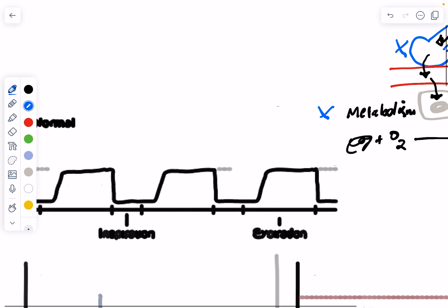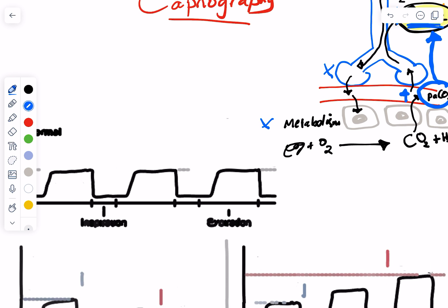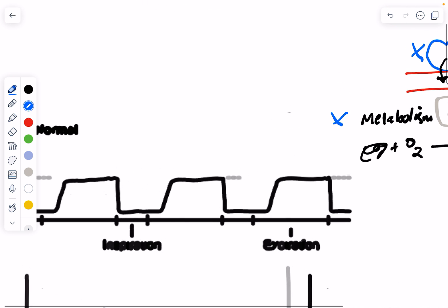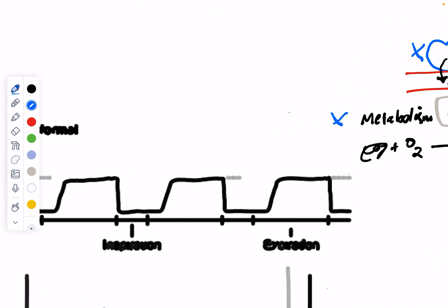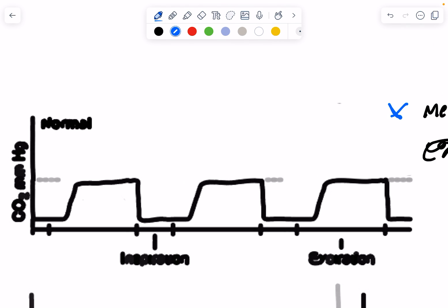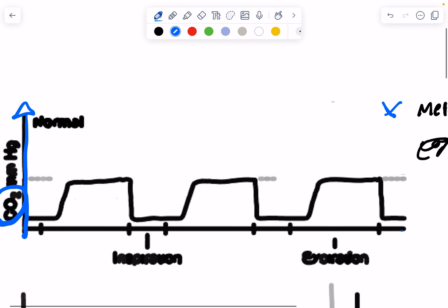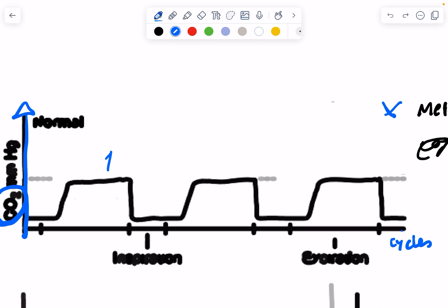So with this background, I want to show you different waveforms. Number one, let's start with the normal. Take a look at this graph. We have a y-axis here showing us the CO2 in millimeters of mercury. And we have the x-axis showing us the cycles of respiration. So we got one, two, three cycles in front of us here. That means the patient is breathing in three times per the time period that we recorded.